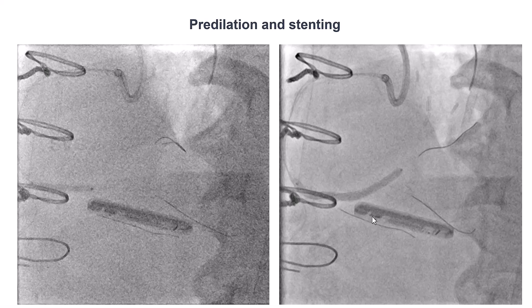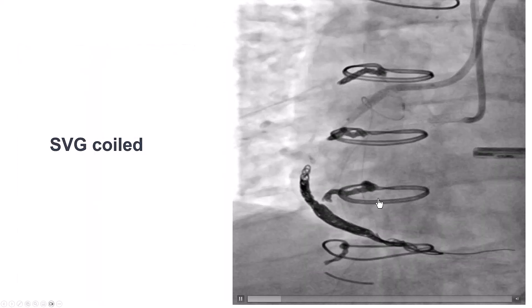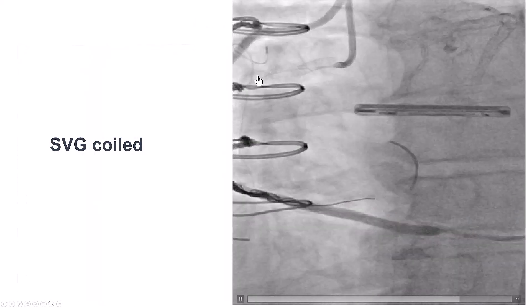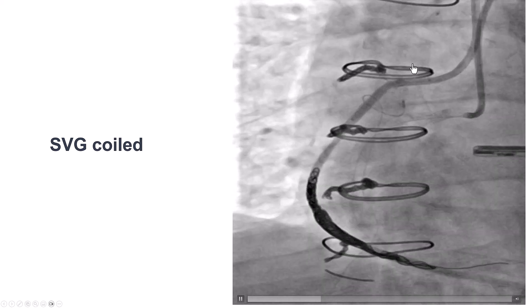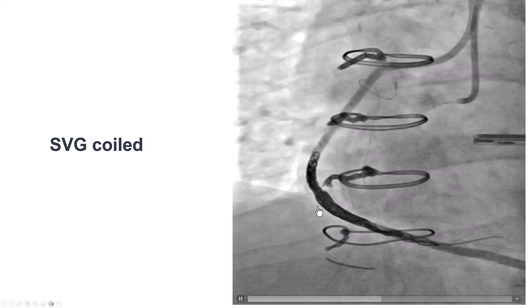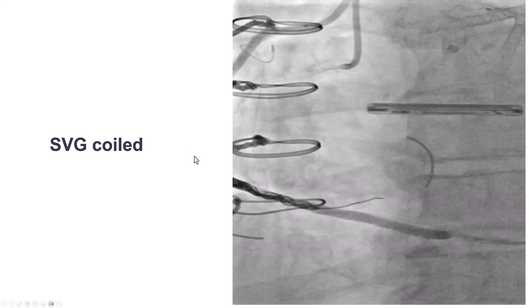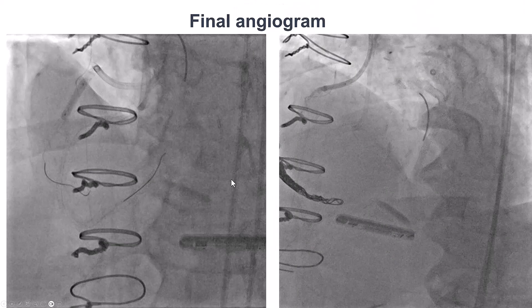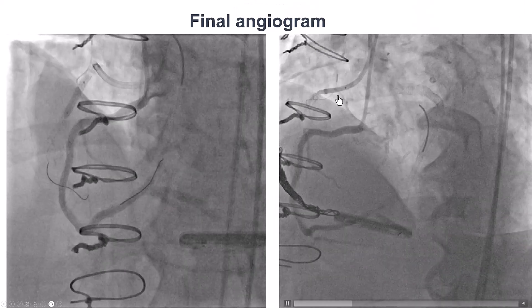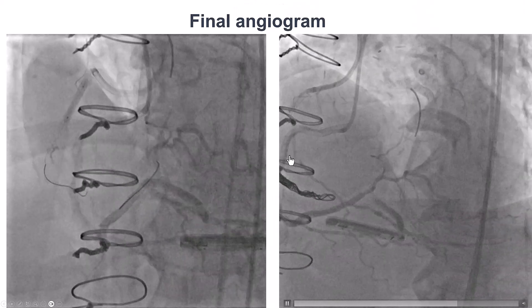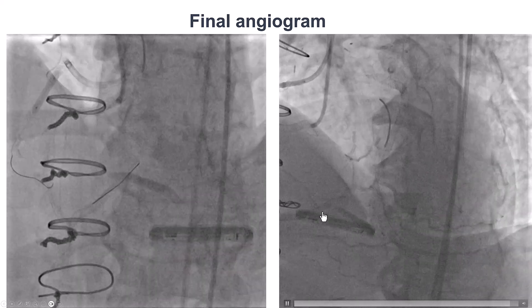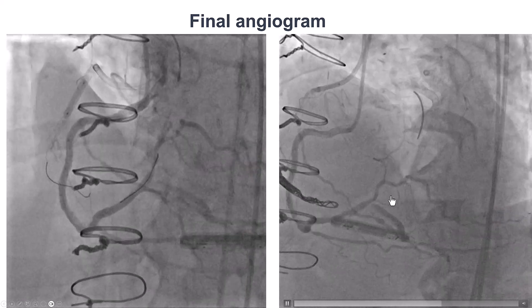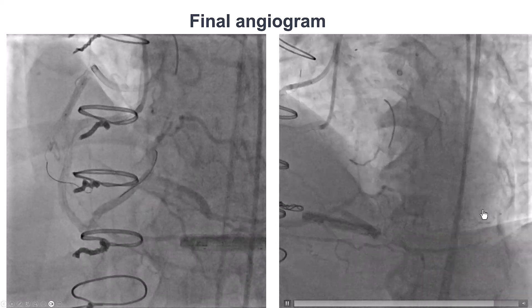We predilated, stented, and got a nice result. Because there was strong competitive flow from the vein graft — which had been ballooned to allow for this — we ended up placing coils to occlude it. And this is the final angiogram. We did have nice antegrade flow into the distal RCA, PDA, and right posterior lateral.